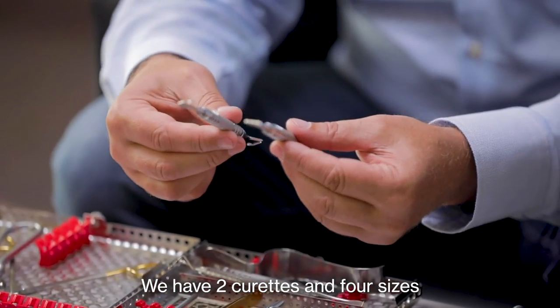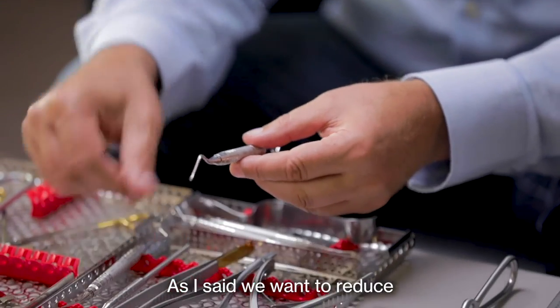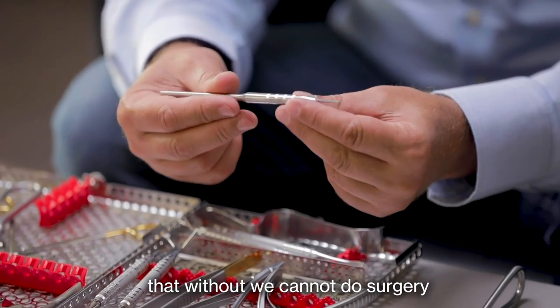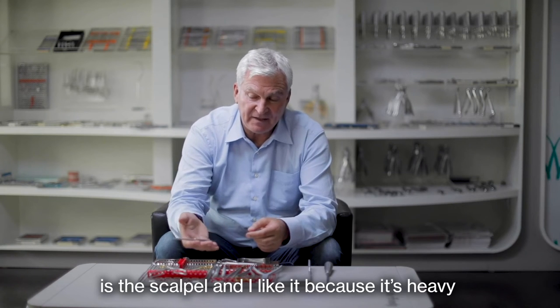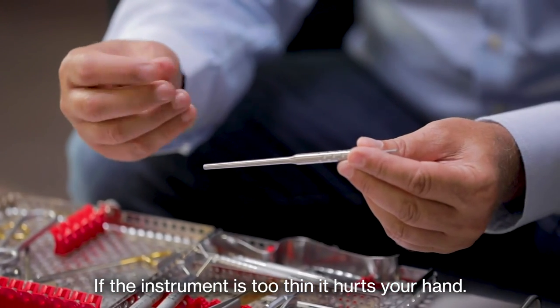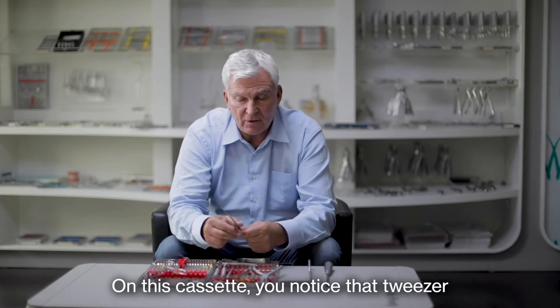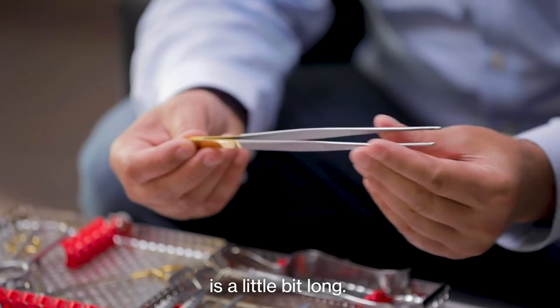We don't need a lot of curettes — we have two curettes in four sizes, and with these two you can basically do everything. We want to reduce the number of instruments as much as possible. This is the scalpel — an instrument without which we cannot do surgery. I like it because it's heavy and nice to hold. If the instrument is too thin it hurts your hand; your hand should not be closed too much or open too much, so this size is just right.